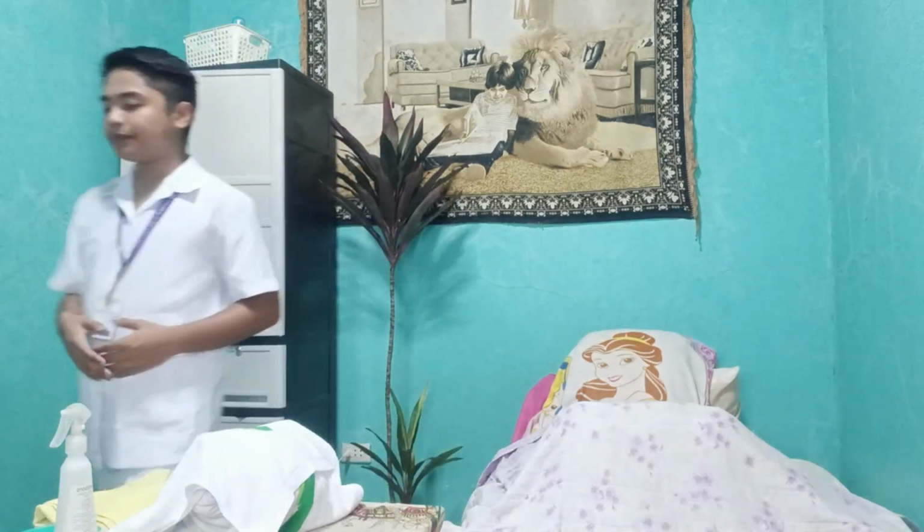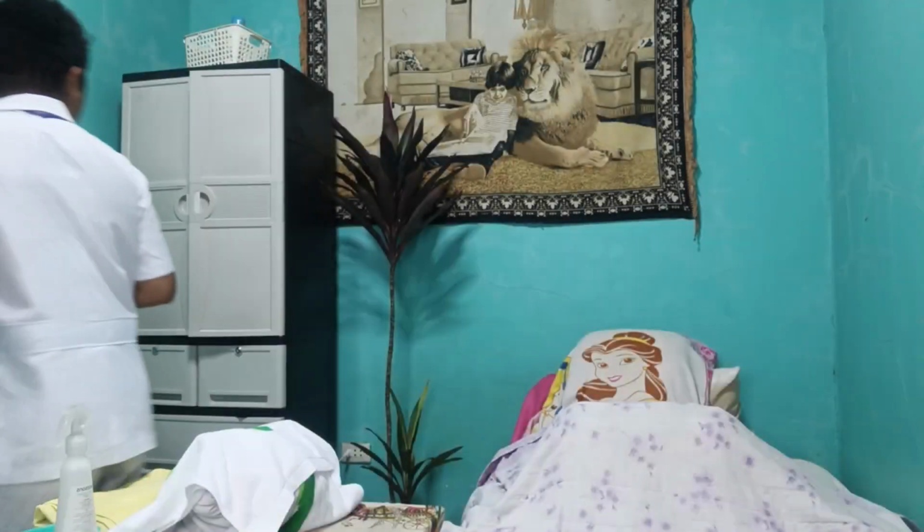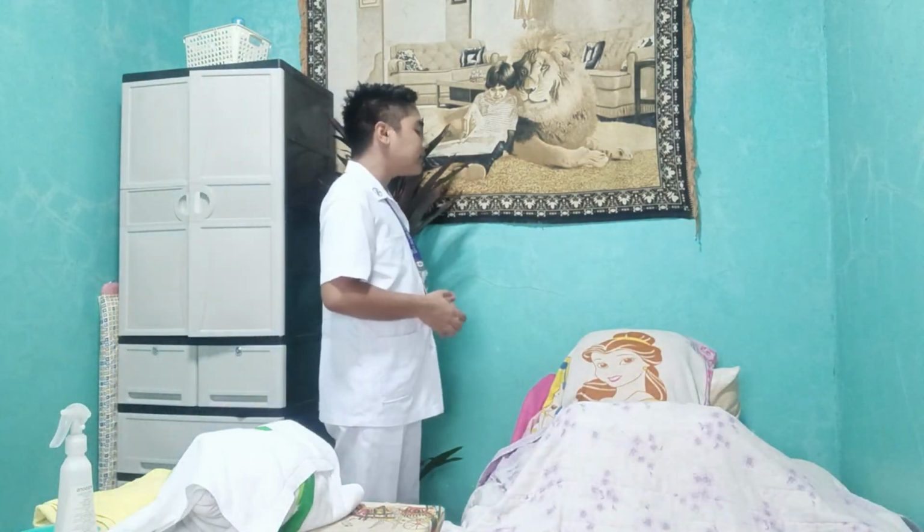Okay, thank you. So before we begin, we need to close the door and curtains so that no one from outside will disturb us while we are doing the procedure, and also to provide the patient privacy and comfort. Okay, so ma'am, are you comfortable with that? Okay. Now, position the patient in dorsal recumbent with knees flexed. This is done to provide good visualization of the meatus where we will be introducing the catheter. Also, gravity will aid the flow of urine when the bladder is higher than the end of the catheter.